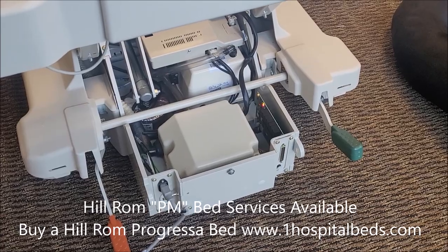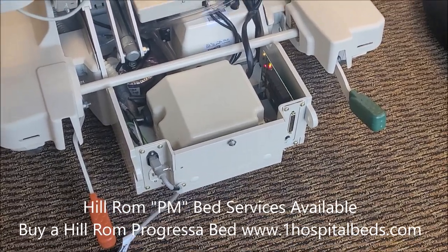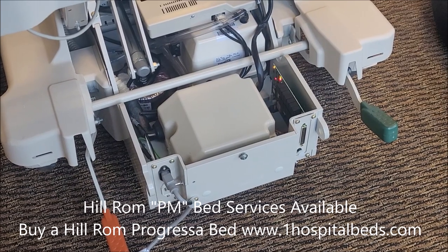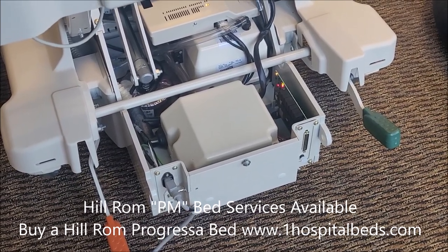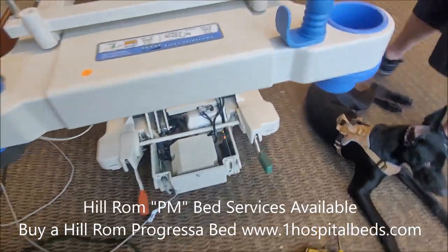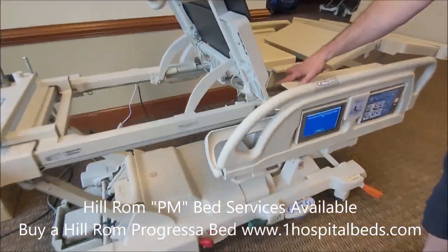It's a huge difference. Even something as simple as just one or two drops of oil to lubricate the hinges and all the articulating mechanisms in the bed, your mechanical sections. Those get debris in them in hospitals or in private care facilities. Stuff gets spilled on them. Do you want to just show us where that's at on the bed? There were a couple you had done where I could hear it squeaking before, and once it got done, it was not.